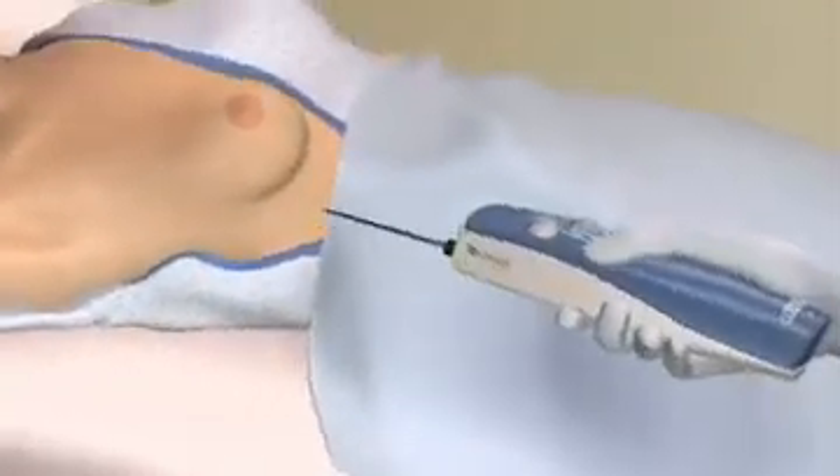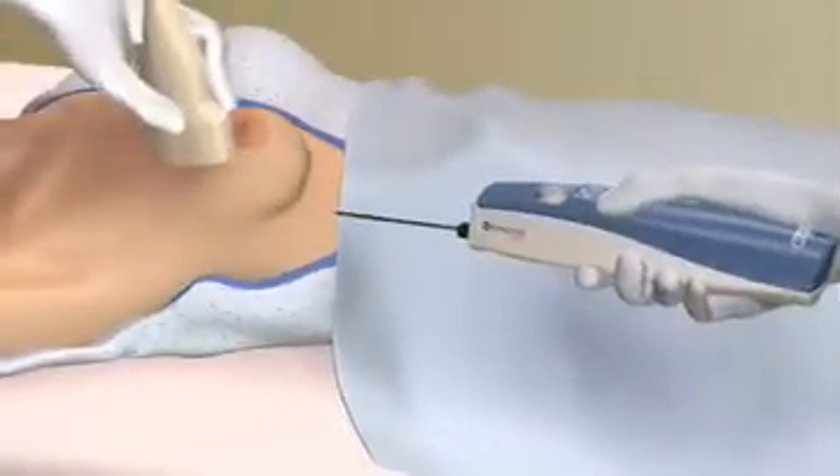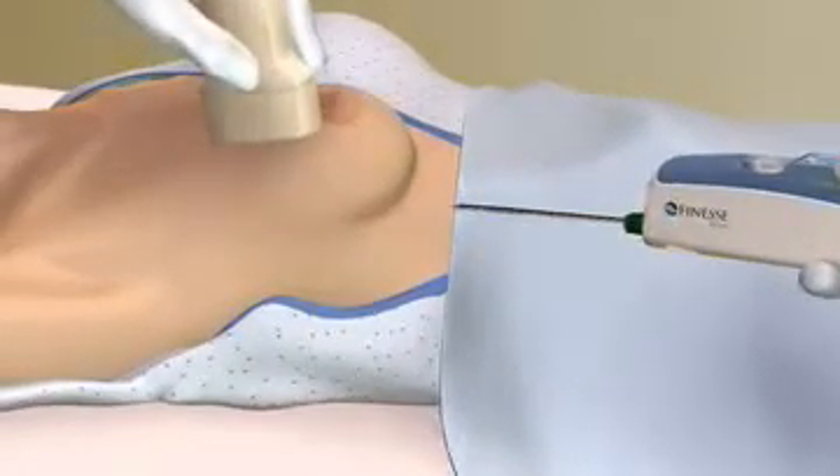Featuring SIMS technology, the Finesse Ultra breast biopsy system allows you to acquire multiple samples rapidly with a single probe insertion. Sampling cycle time is just 10 seconds. This reduces trauma and anxiety to the patient and also improves your procedure room efficiency.